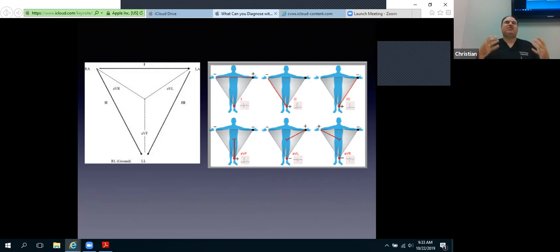So if you just think about looking at a person's heart and imagining an electrical strike occurring, most of that electrical strike is on the left side of the heart, right? So if I'm like here, from your view. And that strike that's occurring is what you're recording on the EKG. So just keep that visual in mind of that's mainly a left-sided strike, right?